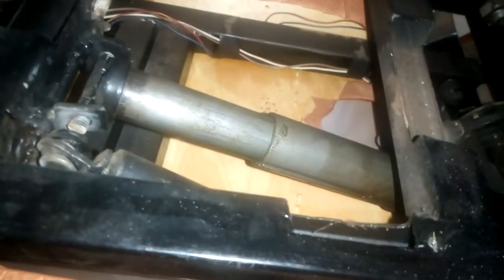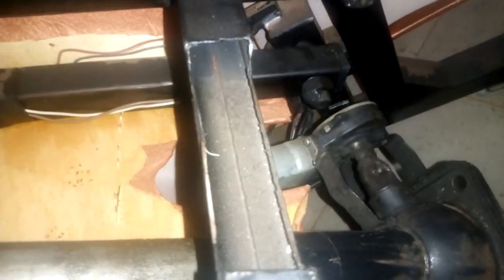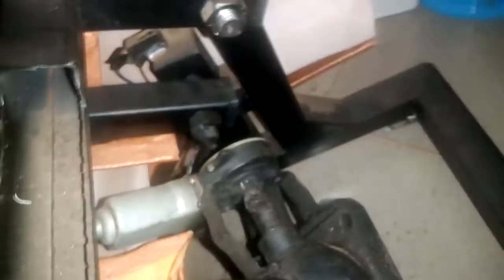And same thing with the upper one, the one that makes up and down movements. When I do this, I realize it's moving, pulling the motor down, lowering the chair. It's going to go up. Let's see. It's turning.